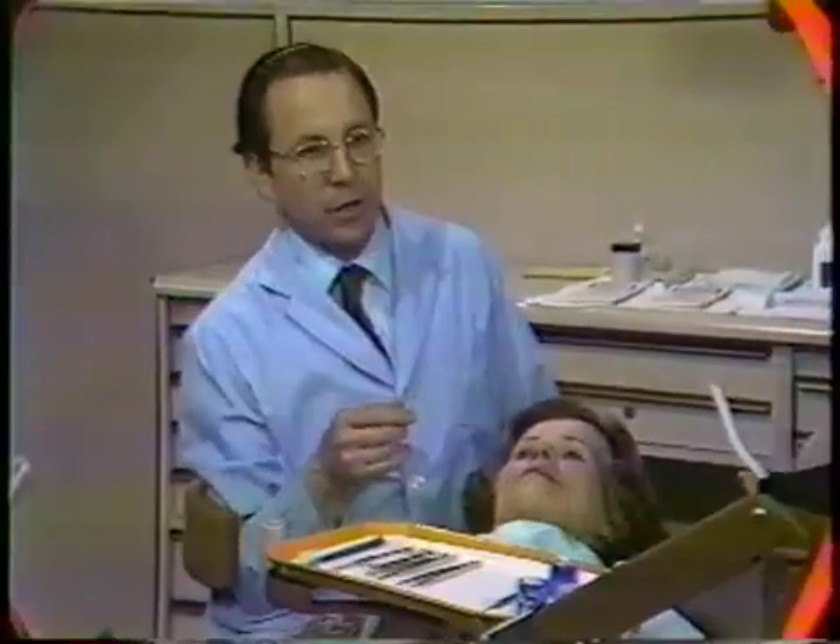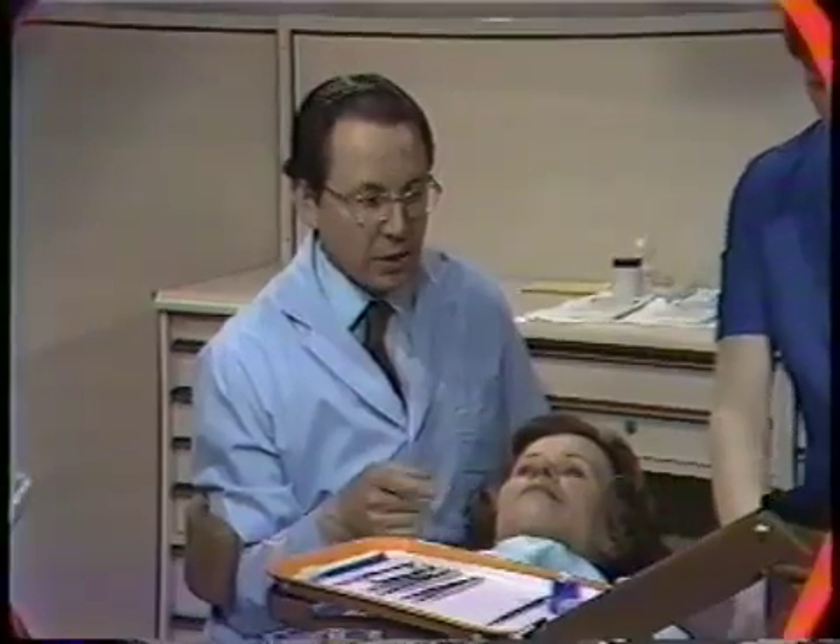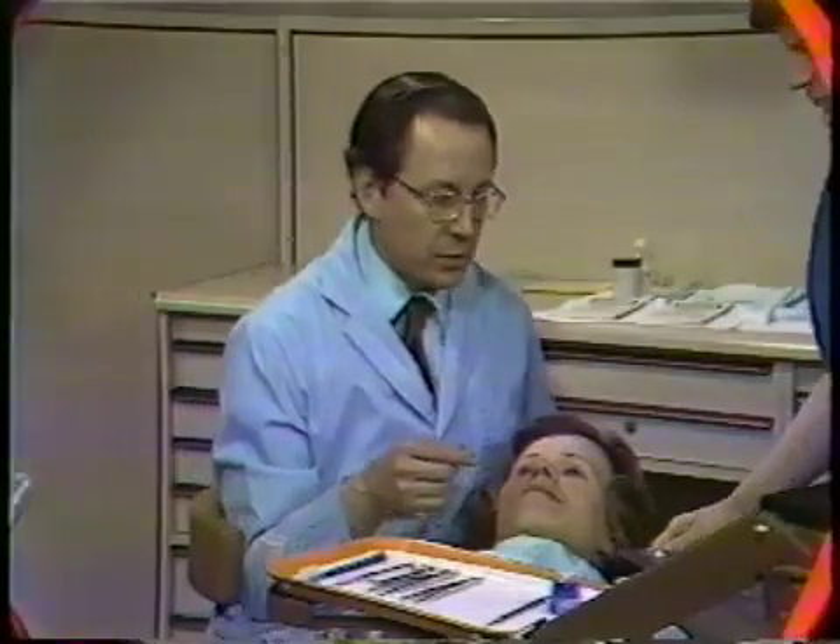Frequently at this time, the teeth are polished with pumice to further clean them, and we're going to do that now. It is also possible, if the tissues are too tender right after removal of a dressing, to do this polishing a week or two later, when the tissues have healed more.